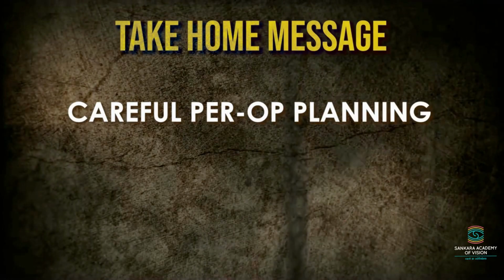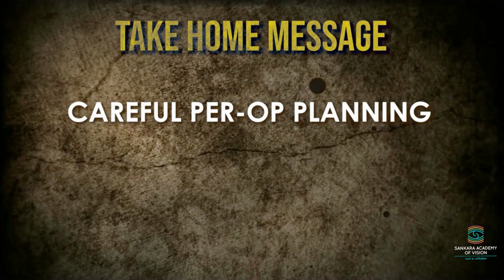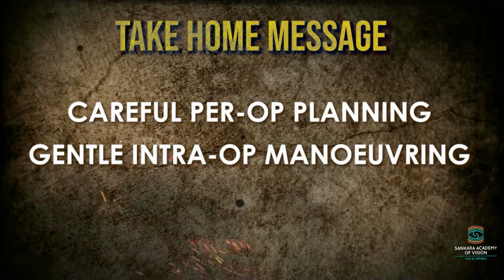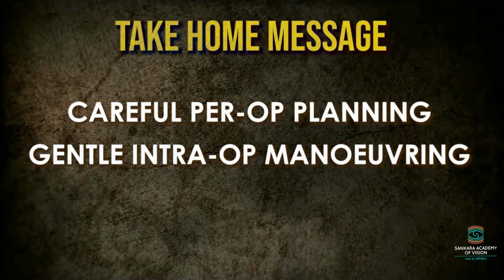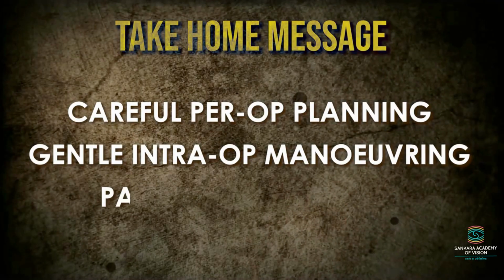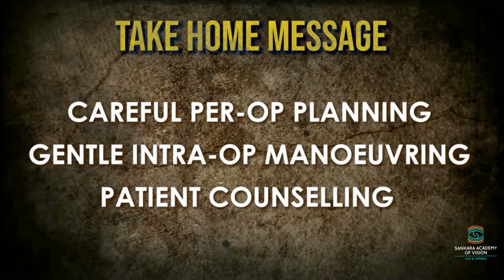Since every case of pseudophakic bullous keratopathy is unique in its own way, careful pre-op planning is needed. In chronic cases of bullous keratopathy, the maneuvering inside the antechamber should be as gentle as possible to avoid antechamber bleeding, which can make the surgery more challenging. Also, it is imperative to counsel the patient regarding the expectations and the outcomes of surgery for better compliance with the postoperative care.